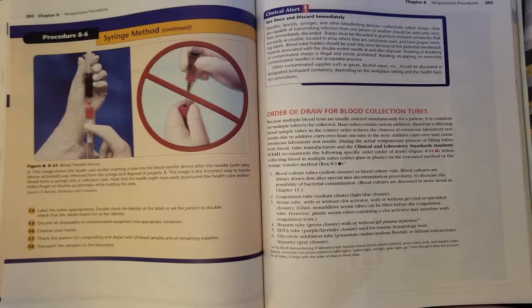Page 202 shows procedure 8.6, or the syringe method, continued. Clinical alert: use once and discard immediately. Needles, lancets, syringes, and other blood-letting devices, collectively called sharps, that are capable of transmitting infection from one person to another should be used only once, then immediately discarded.